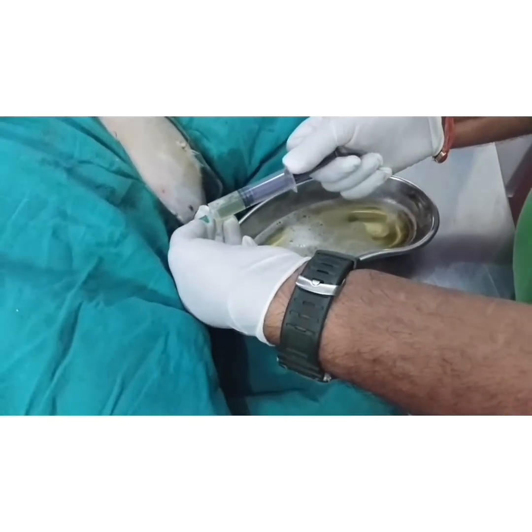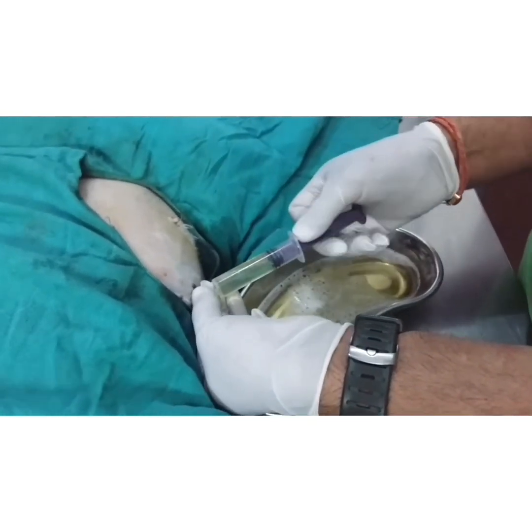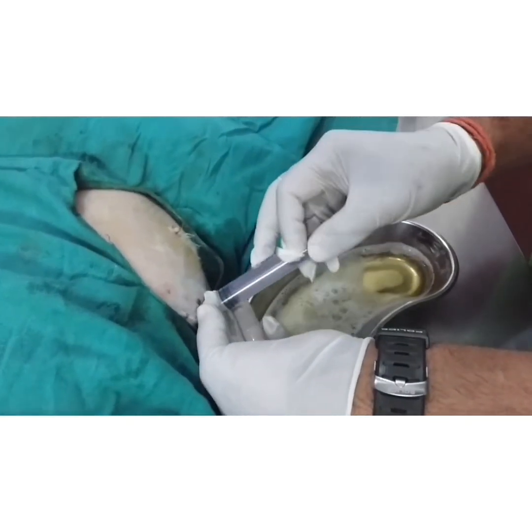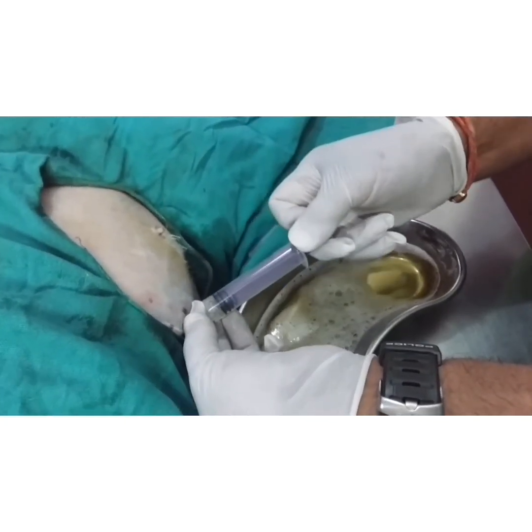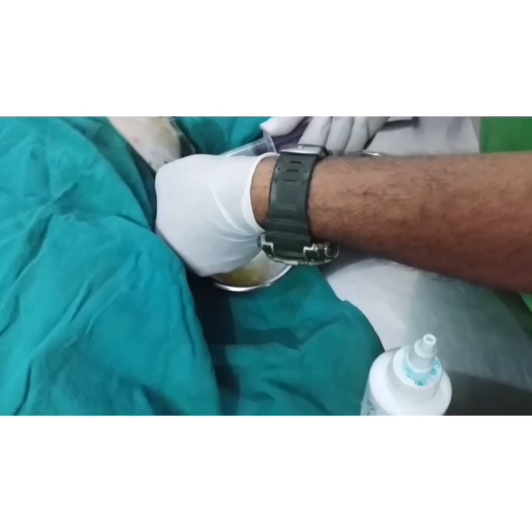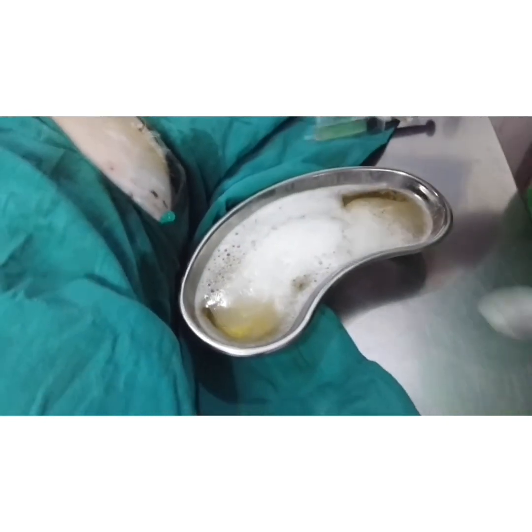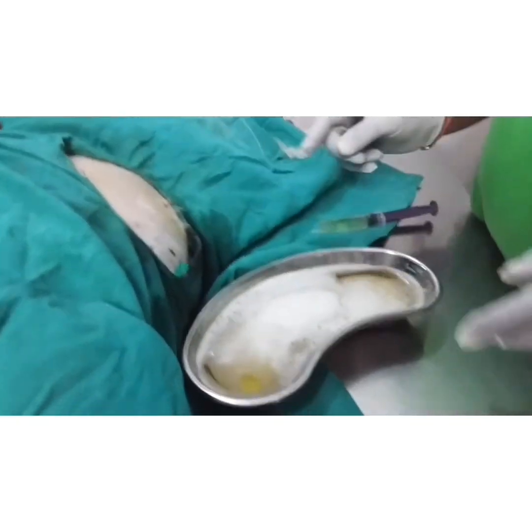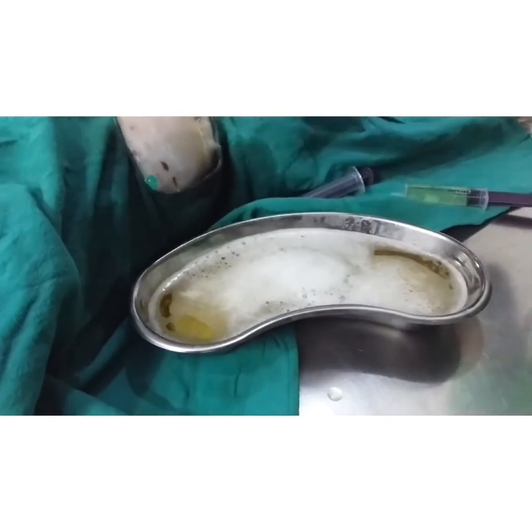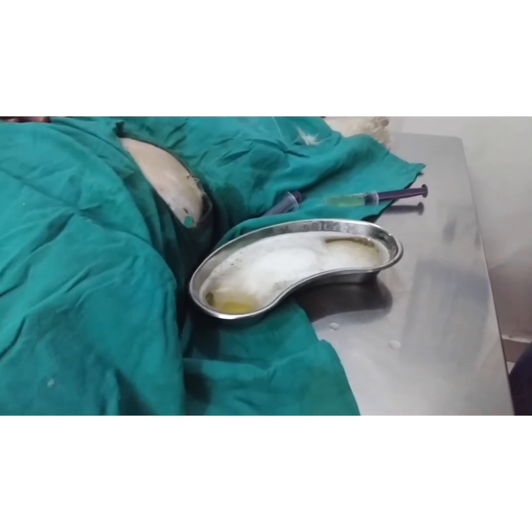The fluid is transparent and not turbid, so I don't think this is infectious peritonitis, and you can see it's really clear — there's no chyle. I have taken out about 300 to 400 ml of ascitic fluid. Now I'll take the needle out, and after taking the needle out you have to apply some antiseptic.